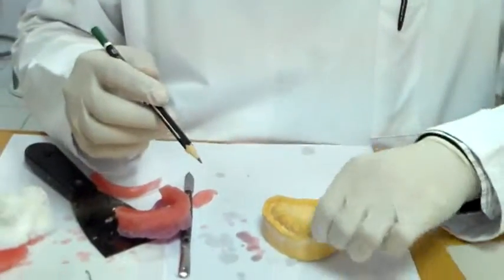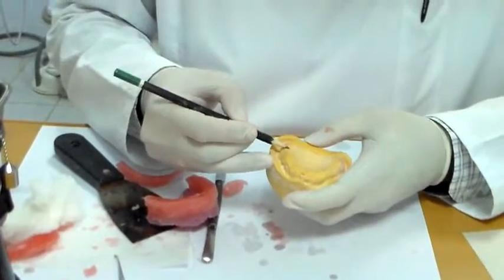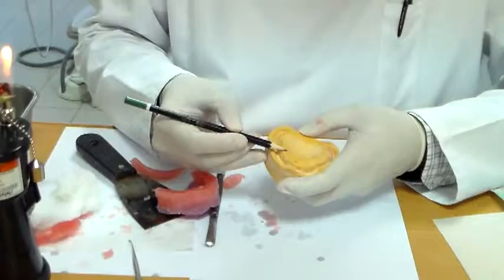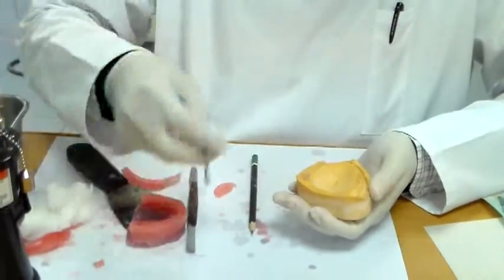You make the upper occlusal rim. You want to mark the crest of the ridge, the straight part of the crest of the ridge, like this, not like this, like this. And even here, we remove this wax.